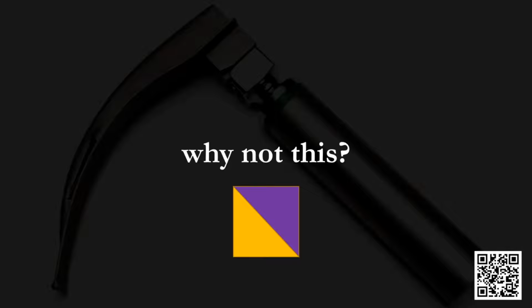So why can we not just use this purple yellow thing? Well, if you've insufflated the stomach with a sufficient amount of gas, you can start to return that CO2 back to the color sensor. You won't have a waveform, and you won't really have a good idea of the qualitative nature of that. The same is true for waveform capnography, but the difference is you will see a decrement in the CO2 level with each additional breath. And by the time you've gotten to 6 breaths, if there's still a waveform present, you're probably in the airway. But if not, then you really need to think twice about it. The colorimetric device, while very convenient and cheap, is not as reliable.